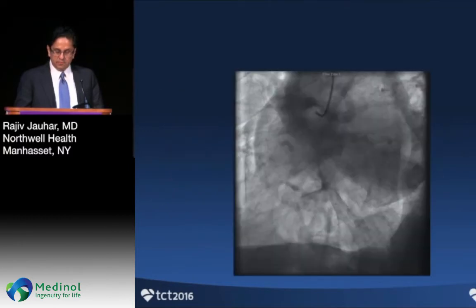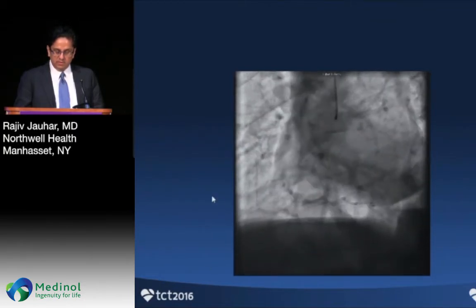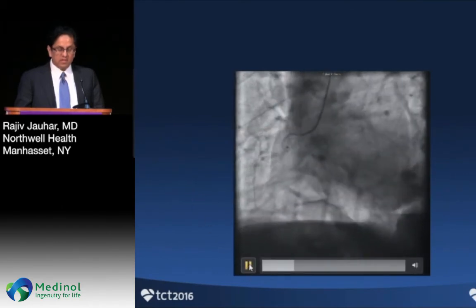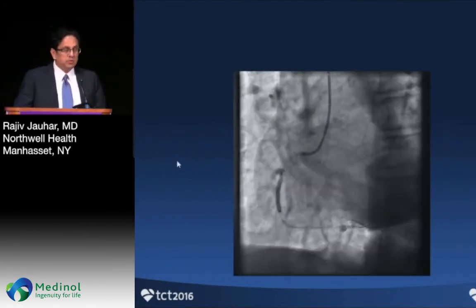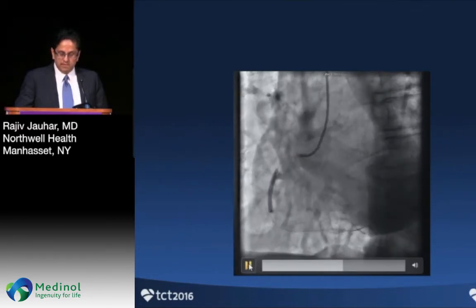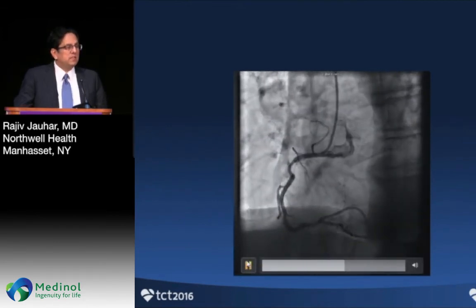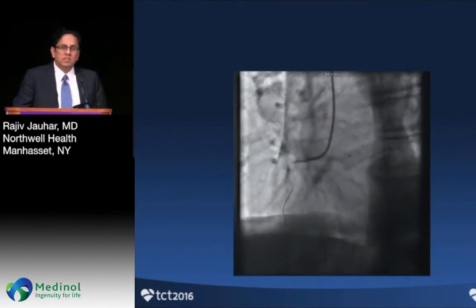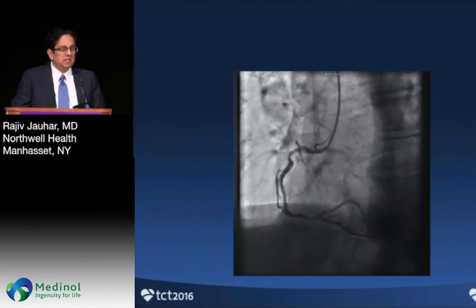The first shot of the right, with not good engagement, shows a mid lesion with a tortuosity in the proximal segment. After pre-dilatation, a 3/24 EluNIR stent was placed with a terrific result. We saw this patient in the office a couple of weeks ago at about 14 and a half months, was clinically doing terrific, had no further chest pain, and felt great.